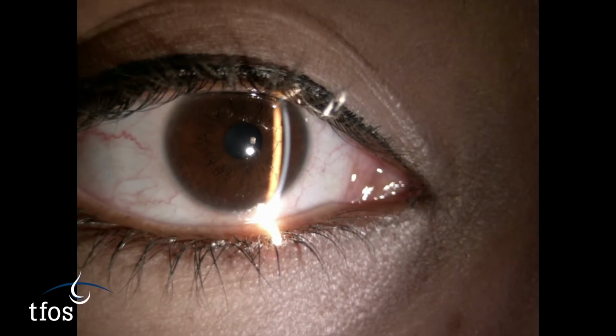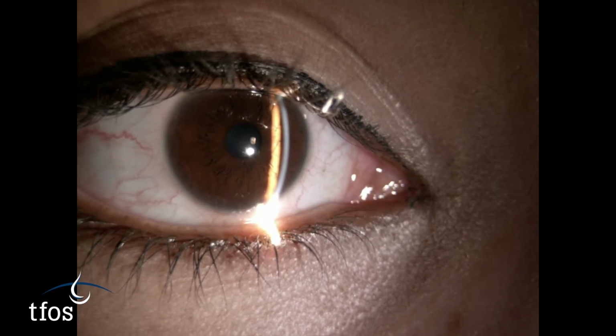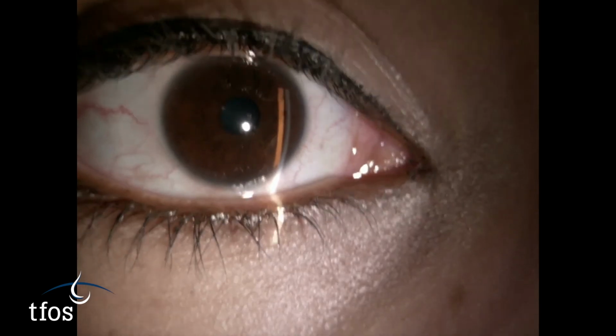Without access to specialised instrumentation, a slit lamp biomicroscope can be used to estimate tear meniscus height. With the patient seated comfortably at the slit lamp, project a narrow width beam of low to medium intensity over the central area of the lower lid margin and increase to medium magnification.